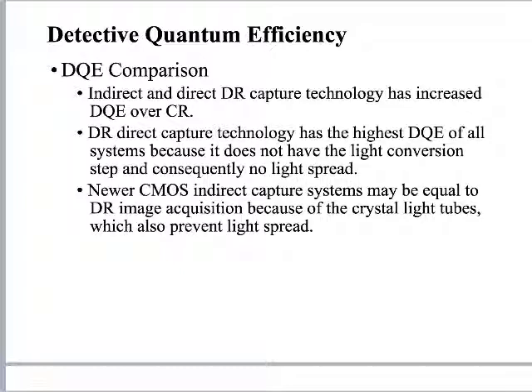The changes that you witnessed, whether or not you realized these were changes, they were changes that were happening in the course of your clinical life. DR systems, the capture technology, again, has the higher DQE of all the systems because it does not have to have the light conversion factor. So direct capture is the best in terms of DQE. There's questions about the new CMOS stuff, but I don't know. I'm not seeing it.